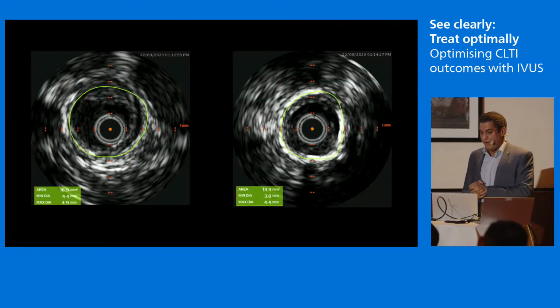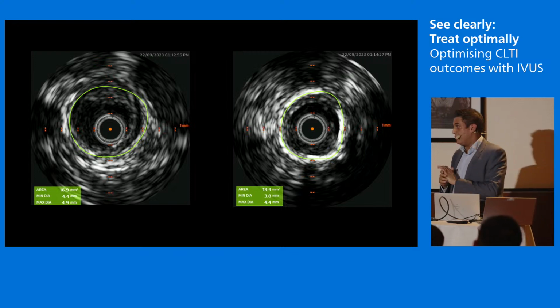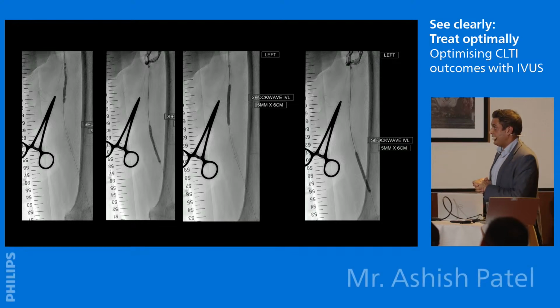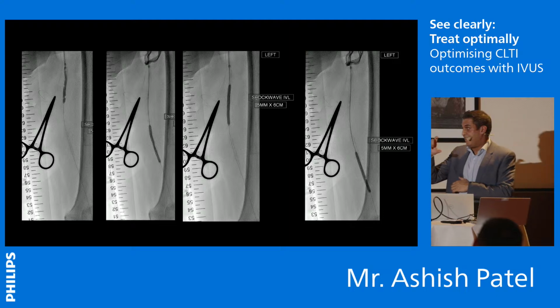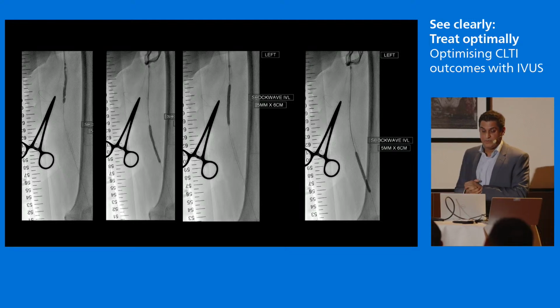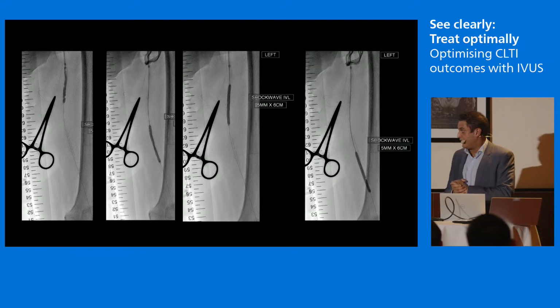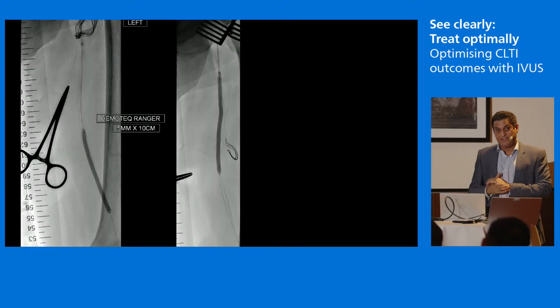Again, I've sized it, and the sizing is to give me an idea of what balloons I'm going to use, what my bailout stents are, and what DCBs I'm going to use. In this situation, I chose to use IVL, targeting those lesions that were especially eccentric. There was a distal lesion, a middle, and a proximal lesion. As you know with Shockwave, you need to size it 1 to 1.1 at least. With the IVUS, you can appropriately size it. So after POBA, straight to DCB.